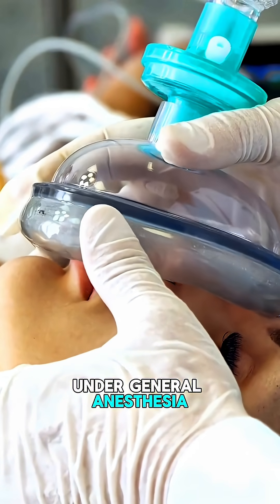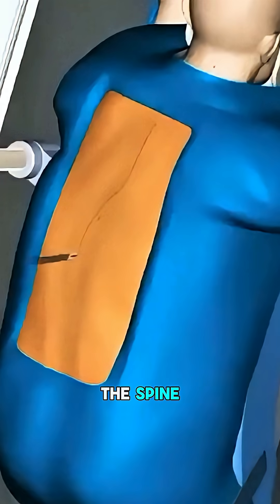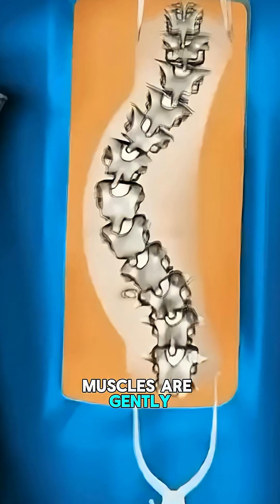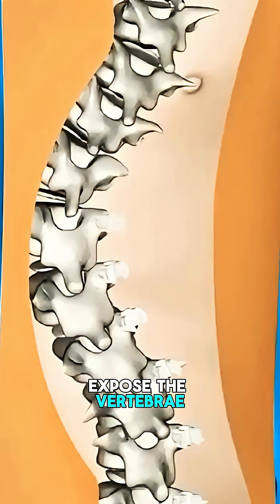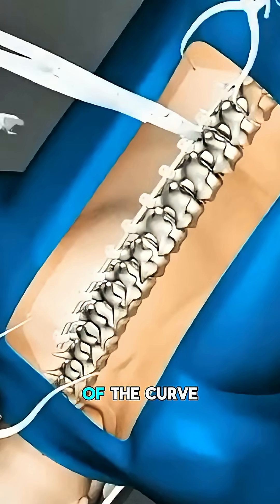Under general anesthesia, the patient is positioned face down. A midline incision is made along the spine. Muscles are gently moved aside to expose the vertebrae. Pedicle screws are inserted into the vertebrae on both sides of the curve.